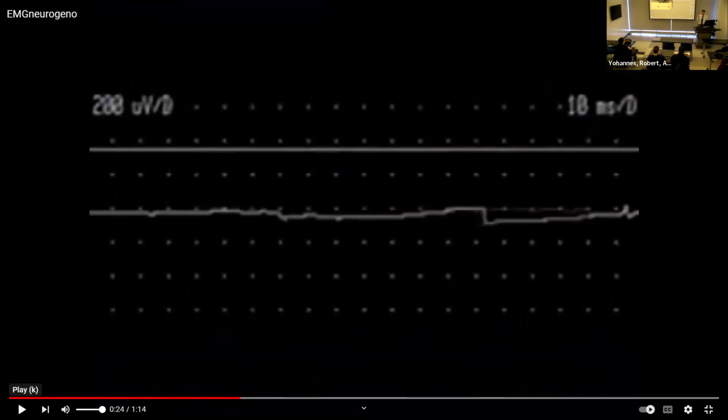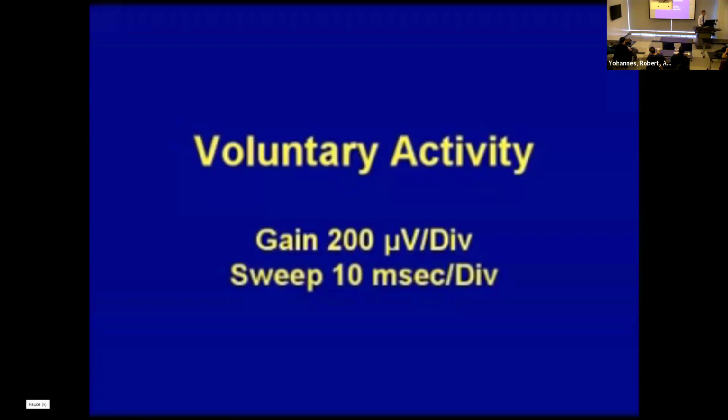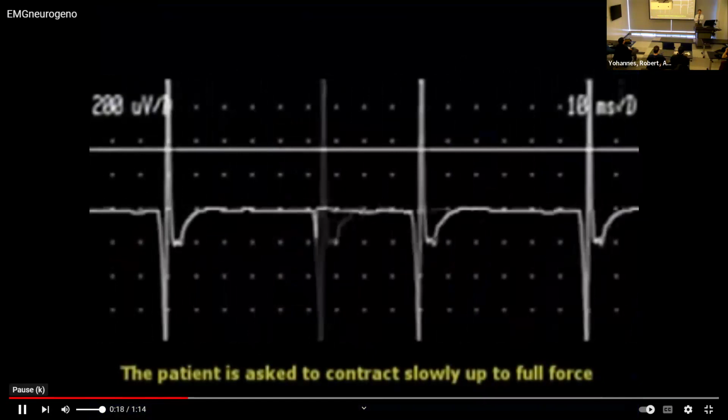It even sounds uniform. So if you compare it to the earlier screen where we increased the rate, we had the incorporation of all the other units, the sound changed. But here, if you listen carefully, it sounds almost machine-like. It's very distinct, and look at the screen, they all look the same because it's the same unit. And then when it reaches maximum activation, we call it a picket fence. It's like a picket fence.